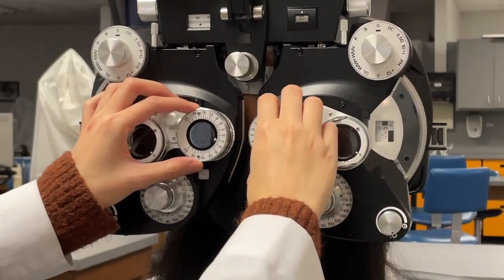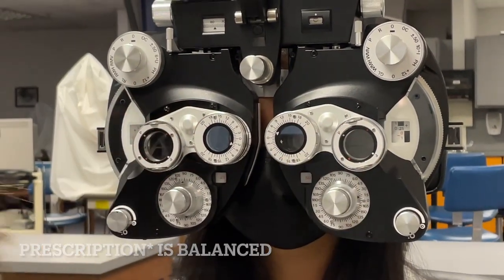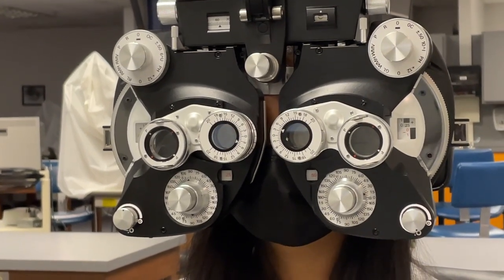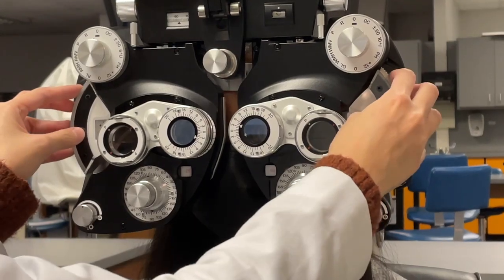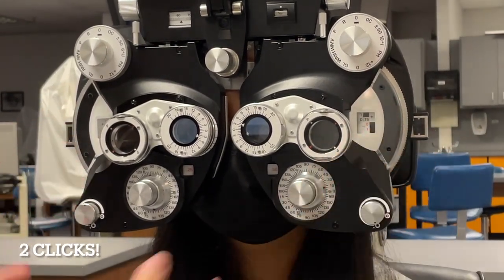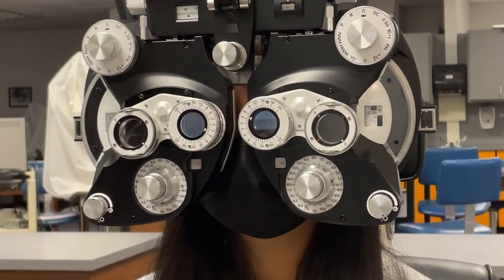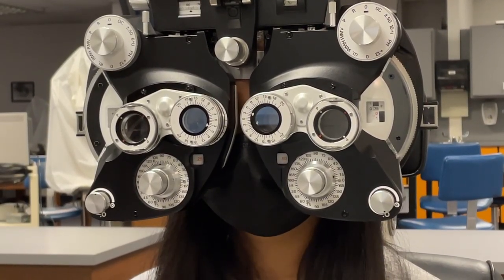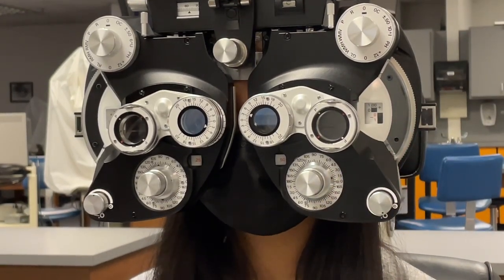All right, Mrs. Lee, I'm just gonna now make sure that your eyes are balanced. So now I'm gonna put up the 20-40 chart. And now you should see 2 charts, one on the top and one on the bottom, is that correct? Yes. Okay, so which one looks sharper, darker, or clearer, or do they look about the same? The bottom one. The bottom one? And what about now? They're the same. Perfect.